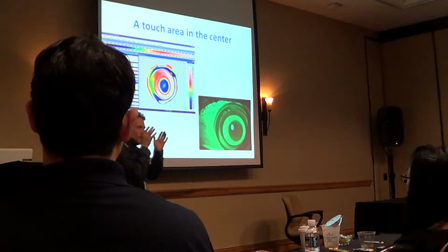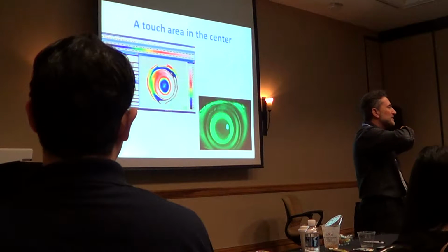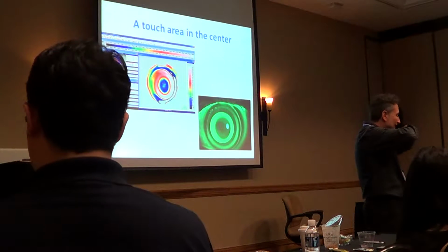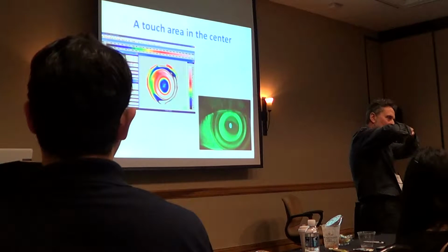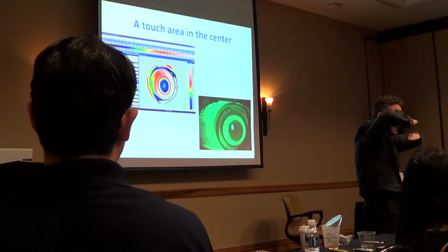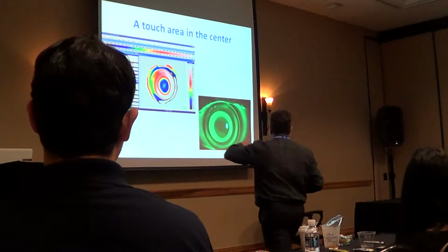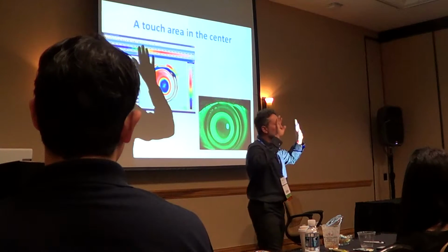Okay. If we follow this, if we just separate the back optical zone from the cornea, if we increase the sagittal height a little bit, we will obtain a centered zone, regular, patient happy, finished.